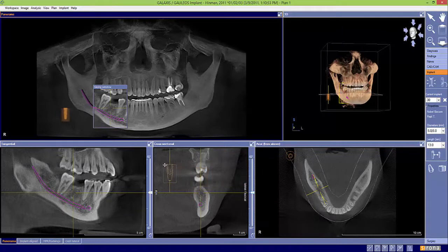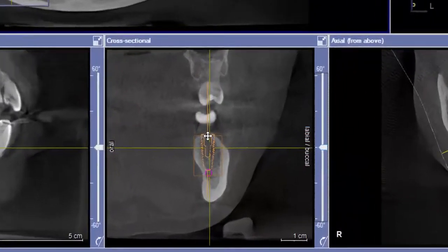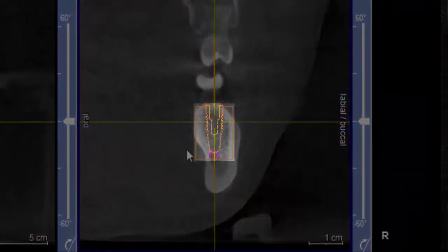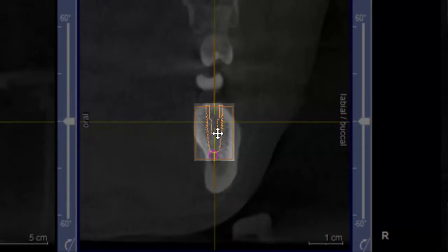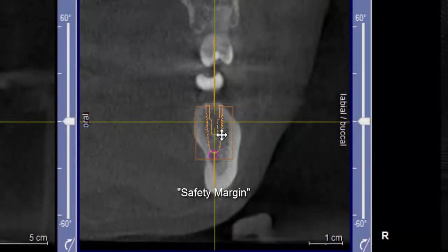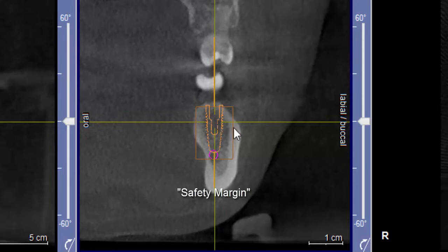And now your implant is attached to the cursor. This is way too long. What we're seeing is a cylinder around the implant. It measures three millimeters from the thread of the implant to the side of the cylinder. On the apical end, it's two millimeters from the implant to the bottom of the cylinder.